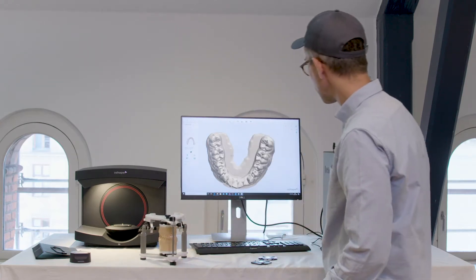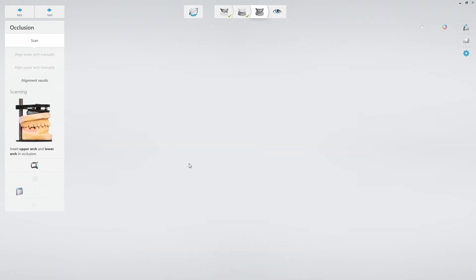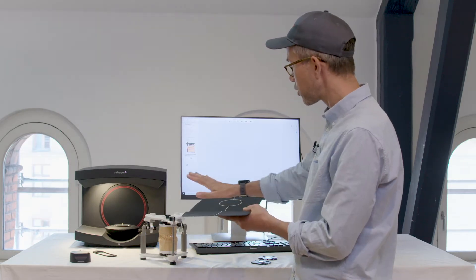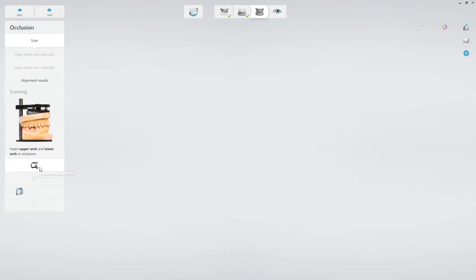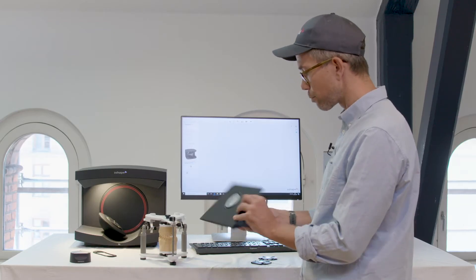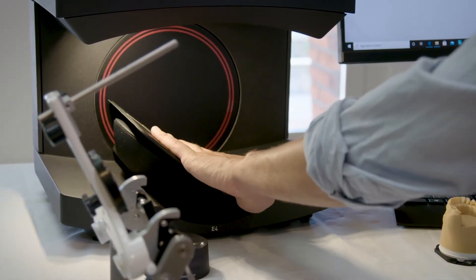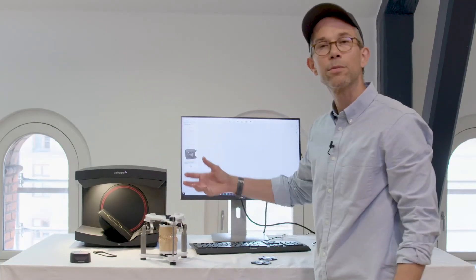So with an articulator, let me show you here. In your articulator you have the option to enable the articulator holder. The articulator holder is this flat surface that you actually need to put into the scanner. Whenever I choose this, it will ask if the scanner is empty. I press yes, confirmed, and then it will go to the side, making it easy for me to place this. It has a magnet on one side which I place so it's going to be fixed.